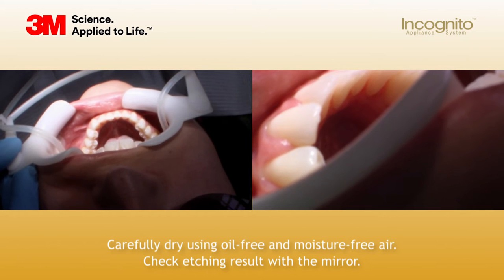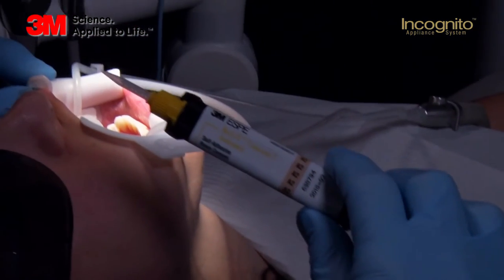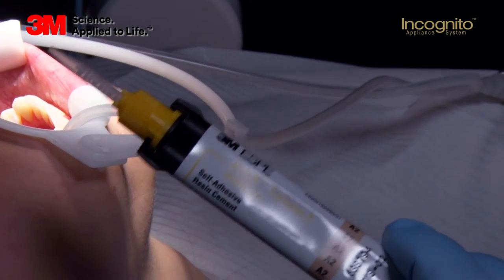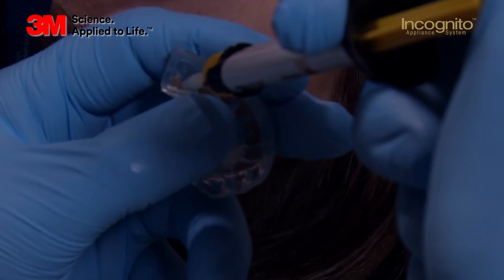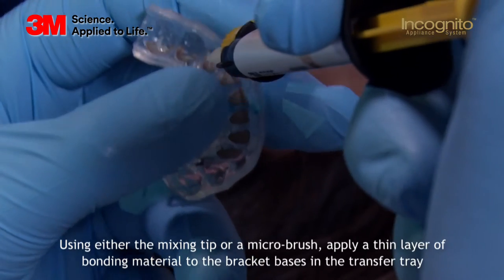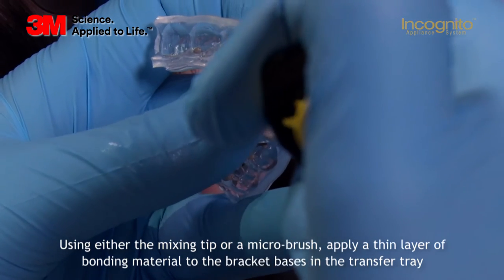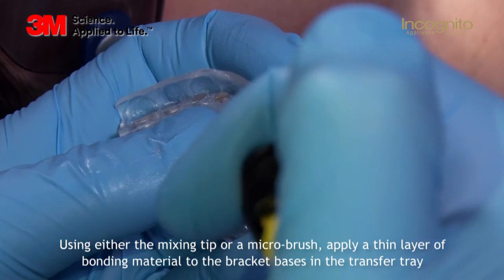We will bond with Relay-X Unicem, which is for me the best bonding material on the market at the moment. It's dual curing, so you have either two and a half minutes working time until it cures chemically, or you can use your curing light to cure it. What we are going to do now is apply the bonding on the bracket base. There is no rush, but you have to make sure that you use enough material — but also make sure you don't use too much, as excess bonding will go into your interproximal spaces.